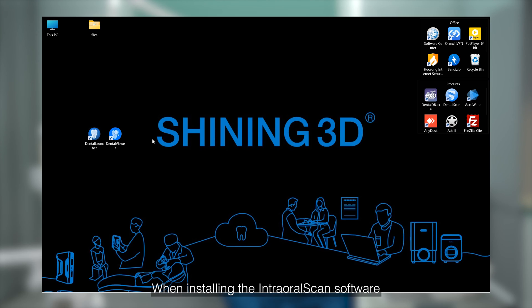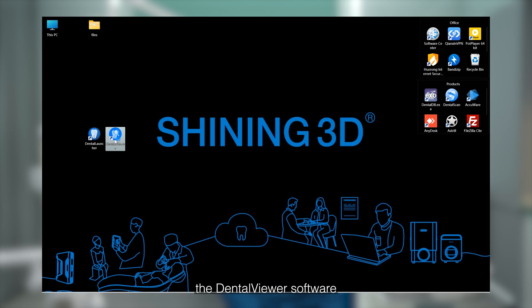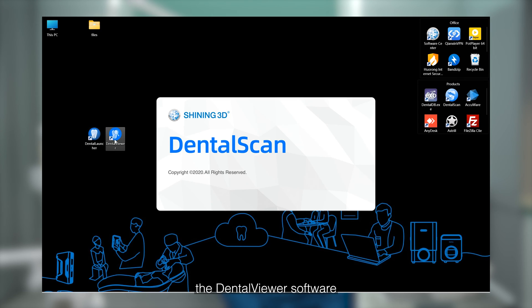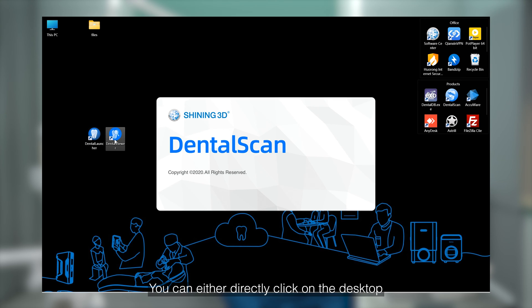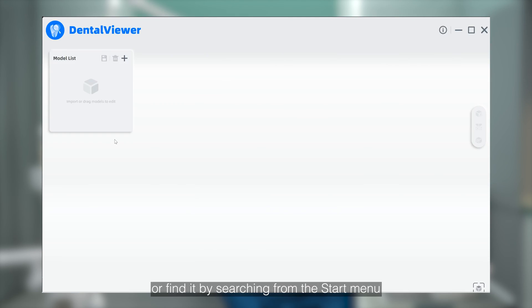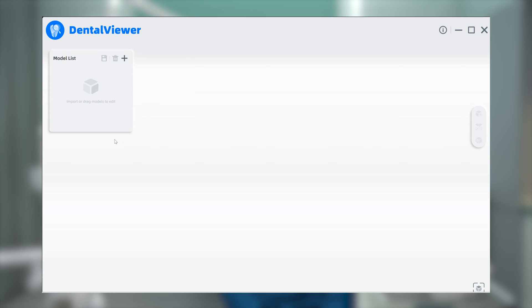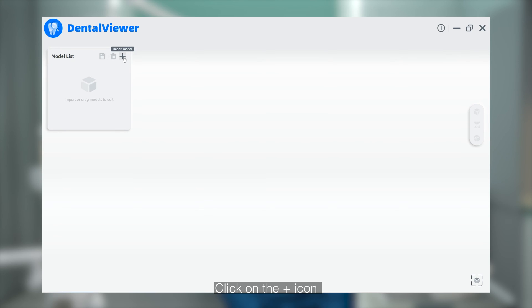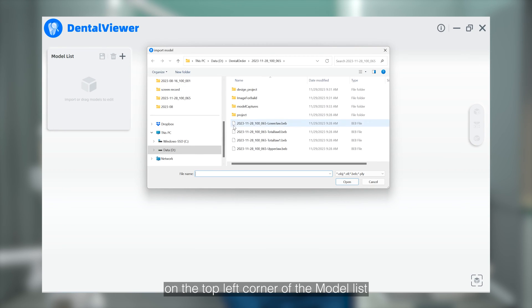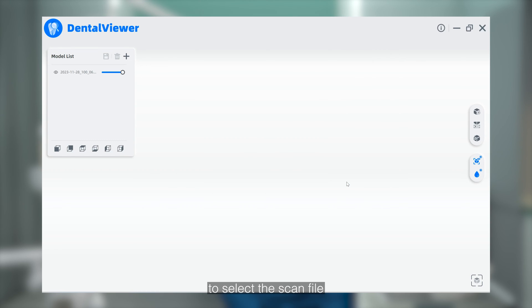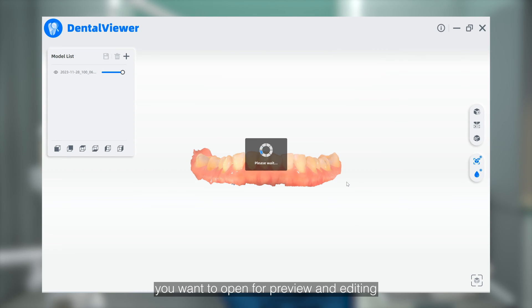When installing the IntraRow Scan software, the DentalView software will be automatically installed as well. You can either directly click on the desktop icon to enter, or find it by searching from the start menu. Click on the plus icon on the top left corner of the model list to select the scan file you want to open for preview or editing.